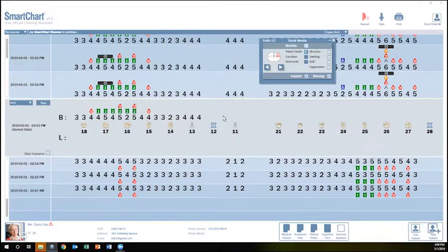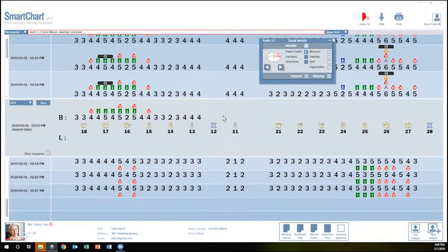SmartChart resume. 4, 4, 4. 3, 2, 3. 3, 2, 2. 3, 2, 3. 5, 2. Abrasion 5. 4, recession 2, 4, recession 2, 4, recession 2. 5, bleeding. 6, bleeding. Suppuration. Furcation 1.